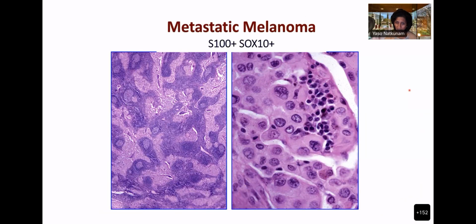Okay, so here is something that mimics a sinus pattern but has very large atypical cells. You can even see pigment in some of them. So don't forget to think about getting keratins. It's S100 positive, of course, because it's a melanoma. So these are things that can mimic it. All right, if you have any questions, then we go to the last case.